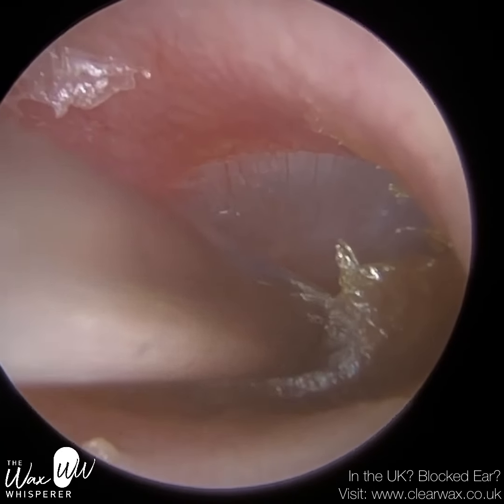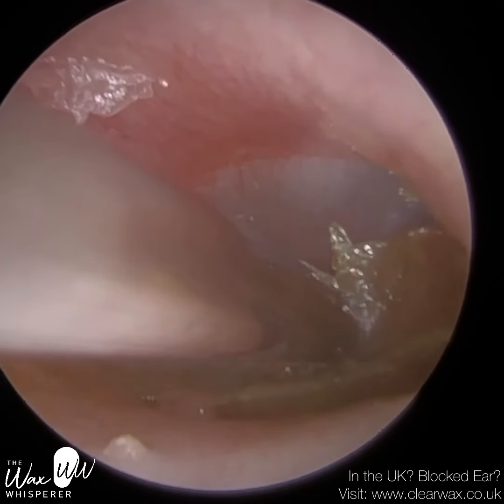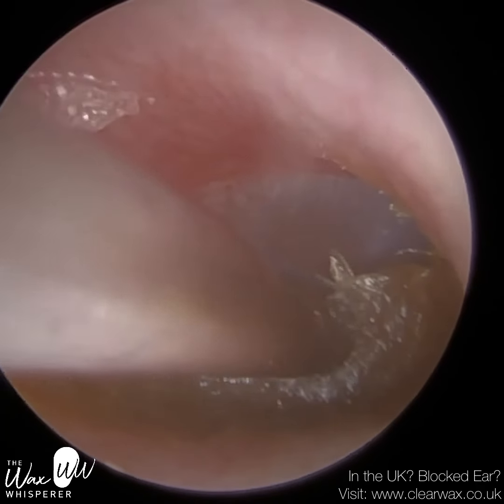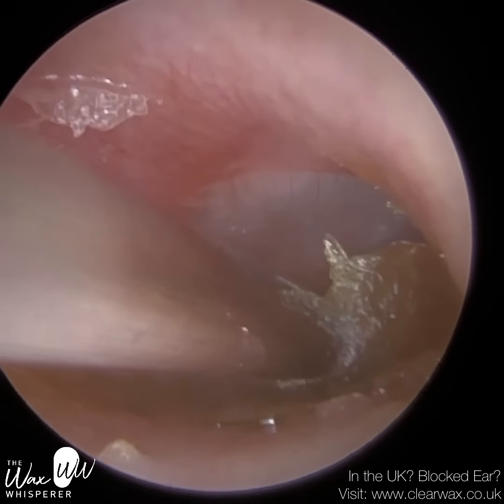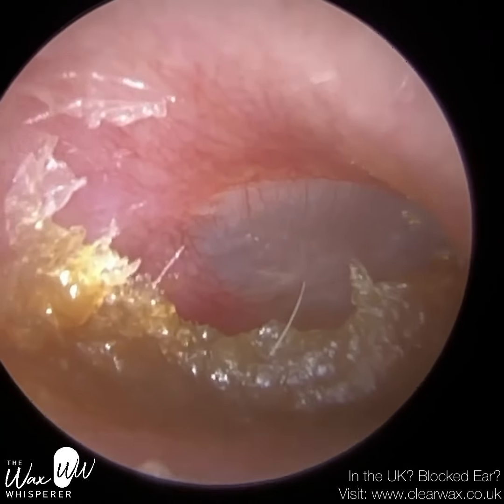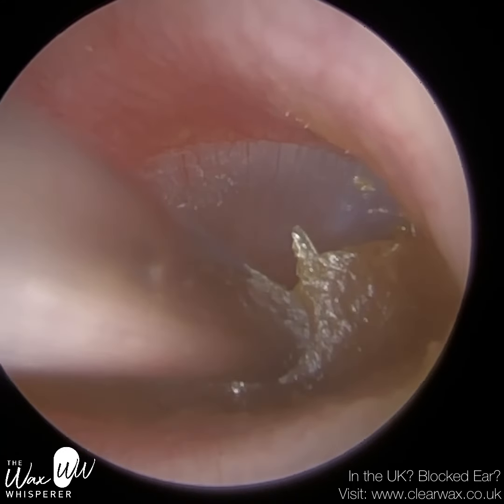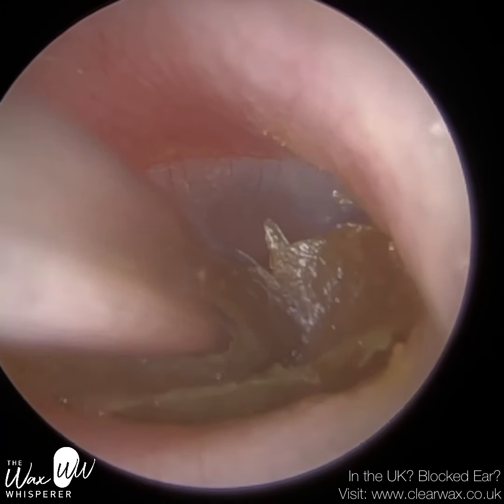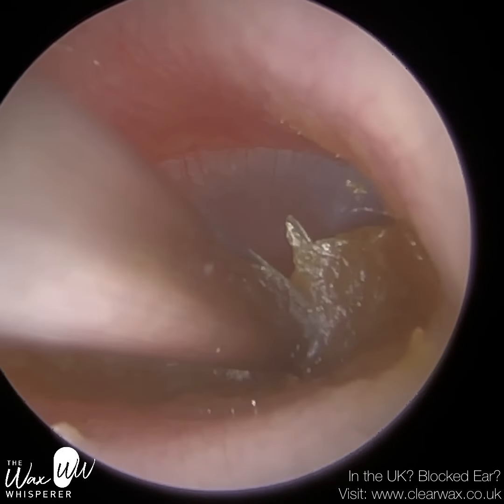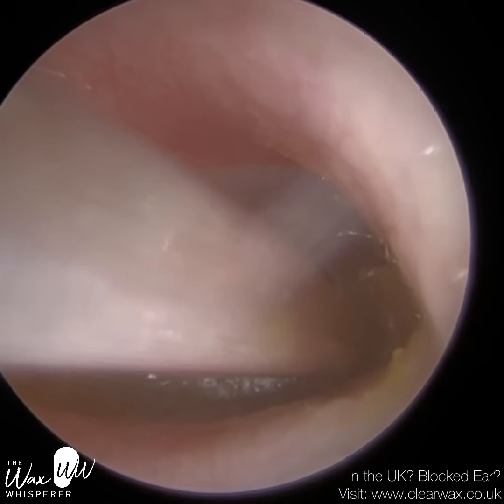In this patient — and it is a chronic problem — the skin fails to fully migrate. It gets lodged within their isthmus. The isthmus is a narrowing of the ear canal about half a centimetre away from where we are now, then the ear canal widens again. What it does is it creates a recess inferiorly — at the bottom. Where I am now, I'm trying to lift this out of the recess, called the inferior recess — it's like a base in a trench. There's also a recess at the front of the ear canal on the left-hand side, called the anterior recess. So you've got to be really careful because we're right up against the eardrum here, but you can just see that skin — it's taking the shape, it's moulded itself in the same shape of the ear canal anatomy.